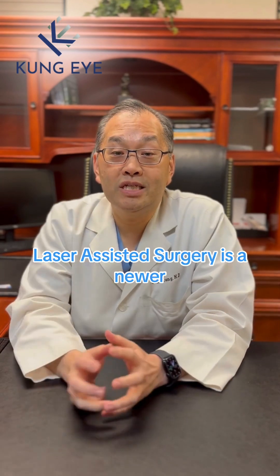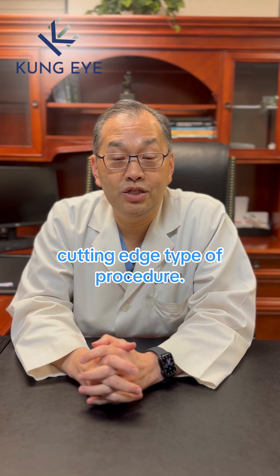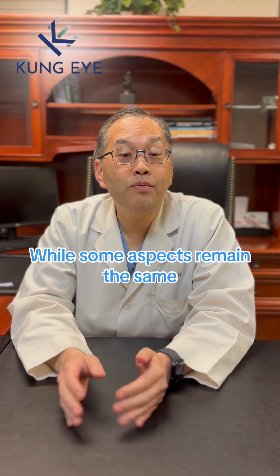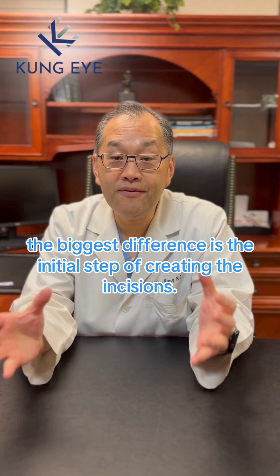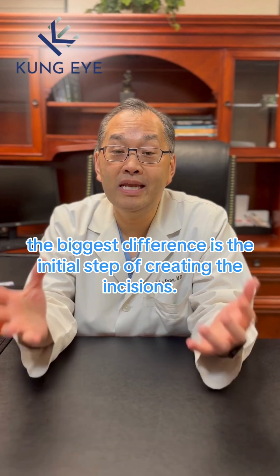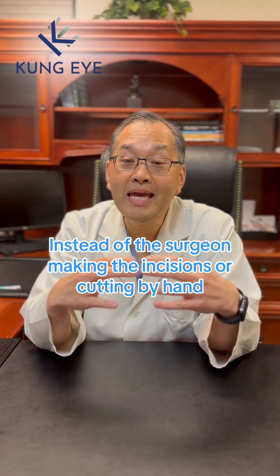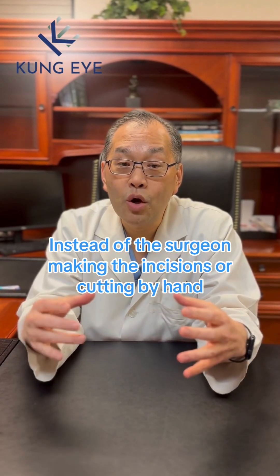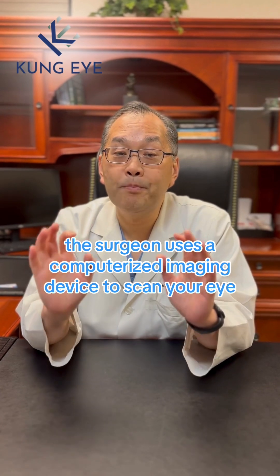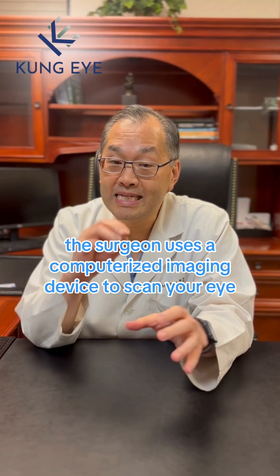Laser assisted surgery is a newer, cutting edge type of procedure. While some aspects remain the same, the biggest difference is the initial step of creating the incisions. Instead of the surgeon making the incisions or cutting by hand, the surgeon uses a computerized imaging device to scan your eye.